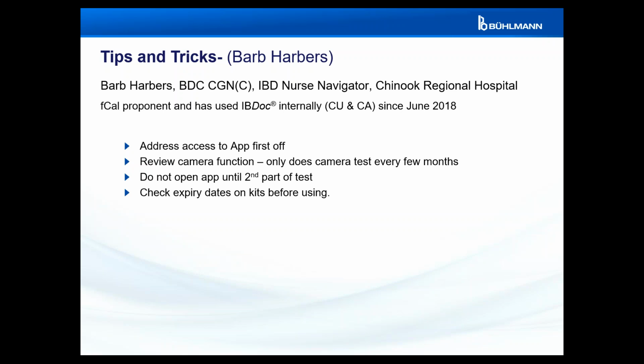My next point on the slide here is to not open the app until the second part of the test. So what I had happen, and these are things I've experienced, so that's why I'm sharing them. I've had patients who would open the app right away, collect their stool sample, but miss that little part that they had to leave it sit for at least 2 hours. And this is usually the first time going through the program, or if it's been a few months and they've forgotten, that can happen as well. And so as they continue to follow the app, they just keep going right through. So the sample hasn't sat for the 2 hours it needs to process. They continue through the windows on the app, and they do their slide, and then they go to take the picture, and of course it doesn't work because nothing's been processed. So to alleviate that whole confusion, our kits come with a really lovely pictogram to follow through.